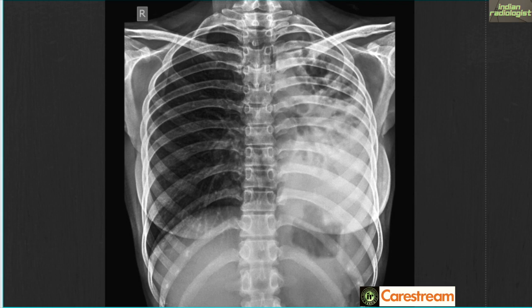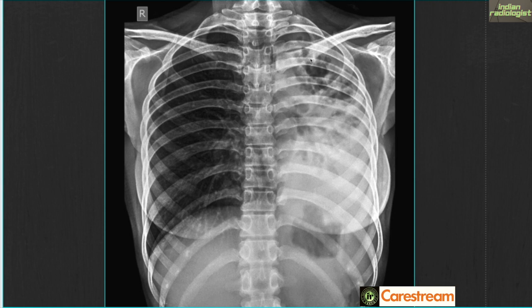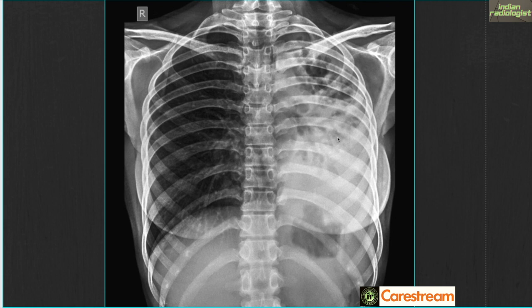This patient has a history of tuberculosis in the past and presents with persistent cough. What we see is destruction and loss of lung volume on the left side — the lung is totally destroyed and replaced by cystic areas. There is a mediastinal shift to the same side: the heart has moved totally to the left, the trachea has moved to the left, and the left dome of diaphragm is raised. Bronchiectatic shadows extend into the lower lobe. This is a destroyed lung with fibro-bronchiectatic changes secondary to pulmonary tuberculosis. The right lung shows compensatory hyperinflation.